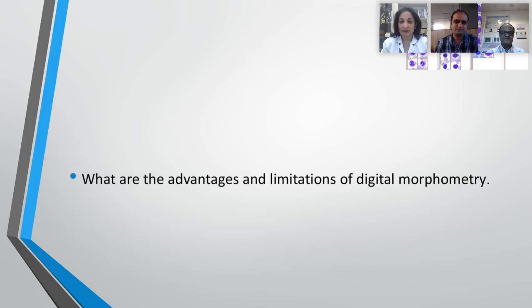Thank you, sir. Sir, there is one question for Dr. Dharav. Is there any time limit for sample processing after sample collection in digital morphometry? No, there is nothing. If you are following the pre-analytical properly, I don't think there's any time limit for that. It is open 24 hours, 365 days. You can open your digital morphometry and you can go ahead.